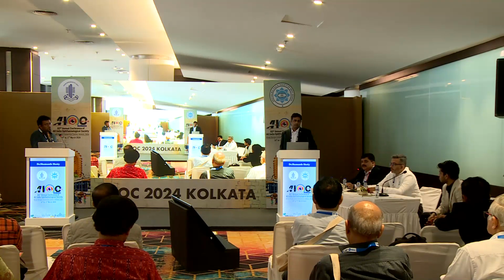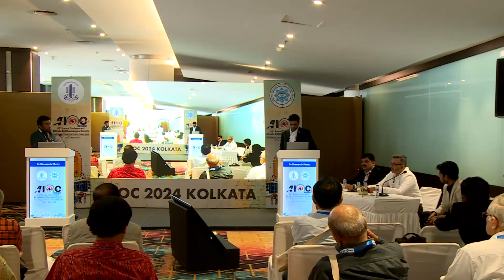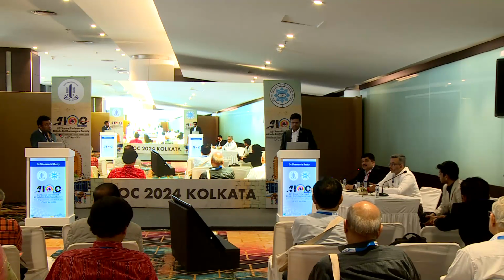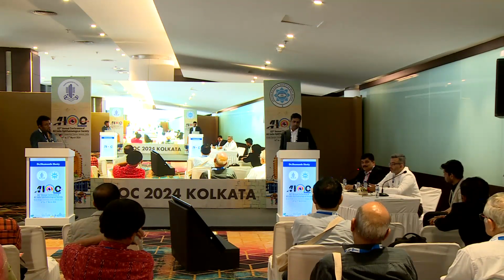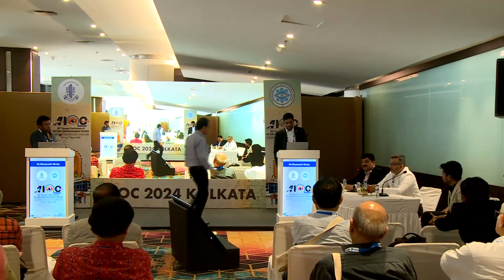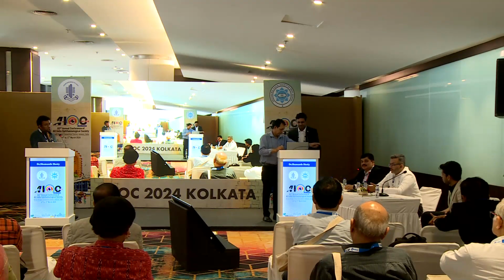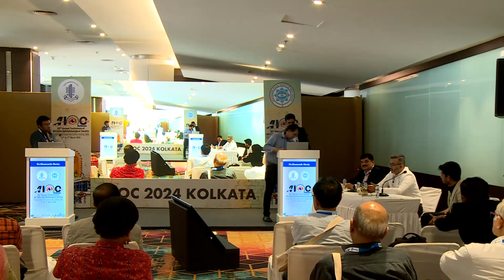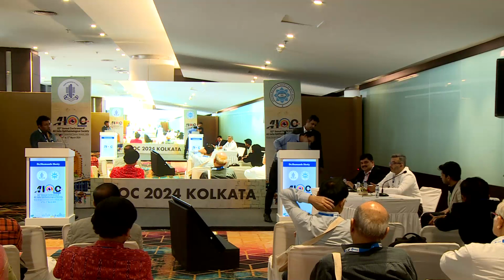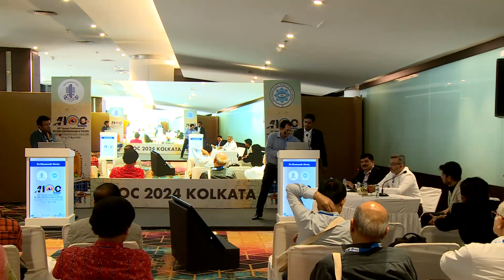Again, there is one more aspect I want to highlight here. When you are going for any of these premium IOLs, think that the patient's angle alpha is already larger. See the other eye also. Still if the patient wants it, you can always play around with both the eyes. That means nowadays for any premium cataract surgeries, knowing the dominant eye of that particular patient is very important.